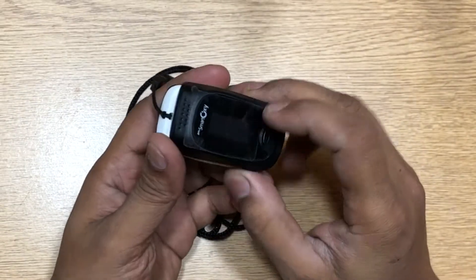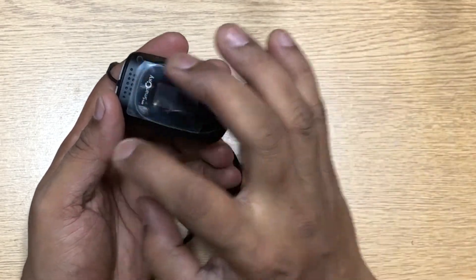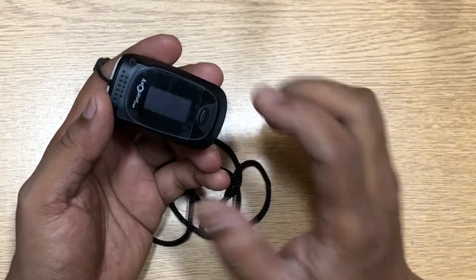This is meant for long usage. You can use other options like bands and phones which show you oxygen level, but they don't give you a continuous reading — you have to switch them on and check at that particular moment. This device gives you continuous oxygen level monitoring.